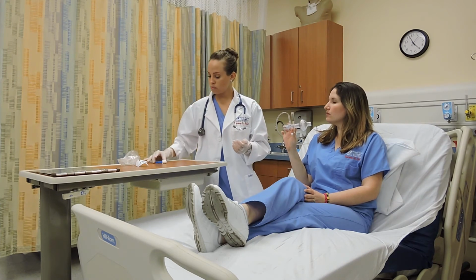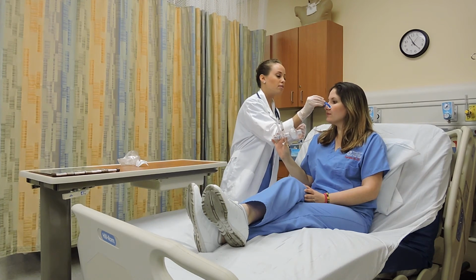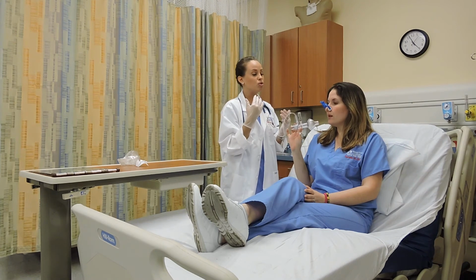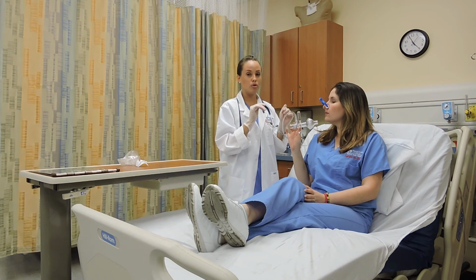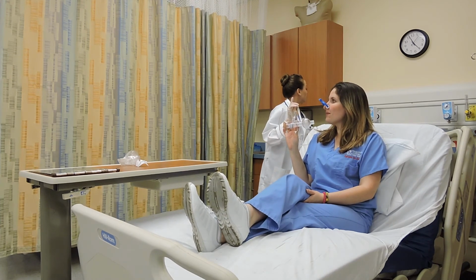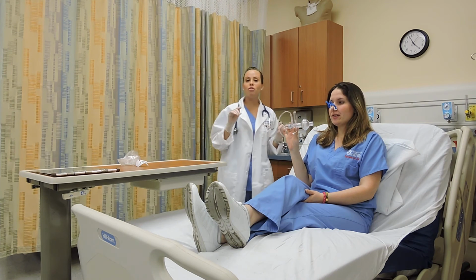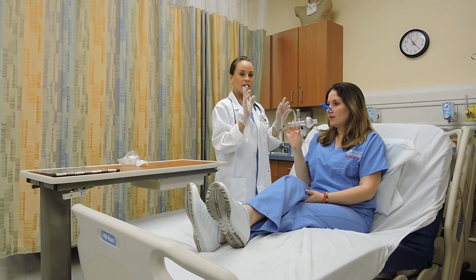All right? I'm gonna place this clip on your nose. This won't hurt. You might feel a little bit uncomfortable, but this is just to make sure that all air is coming through her mouth and nothing is leaking through her nose. Okay, let's do it together. And also, very important, turn your flow meter at 5 liters per minute, all right? Okay, let's do it together.